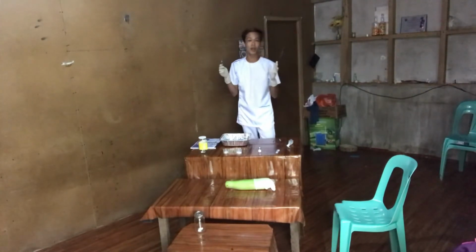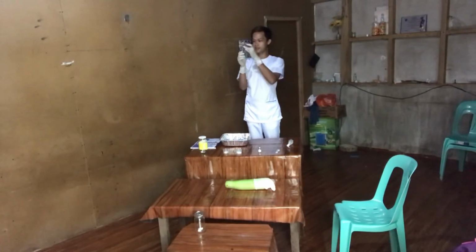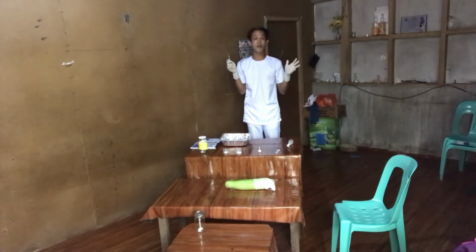We're going to tap the barrel to remove air bubbles. And we're going to remove the aspirating needle and replace it with a new one.